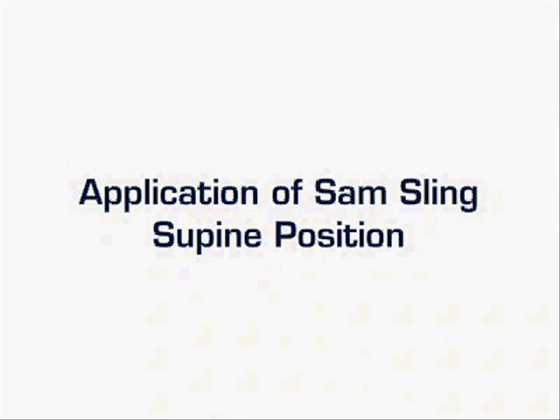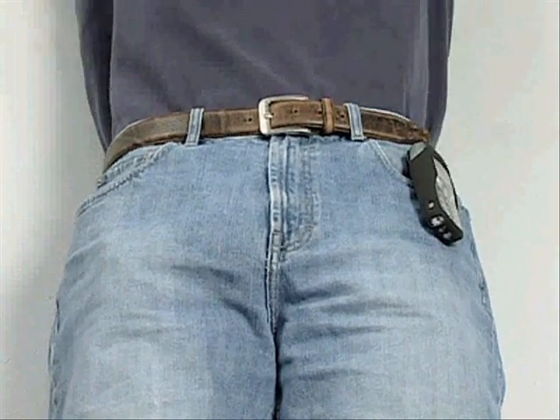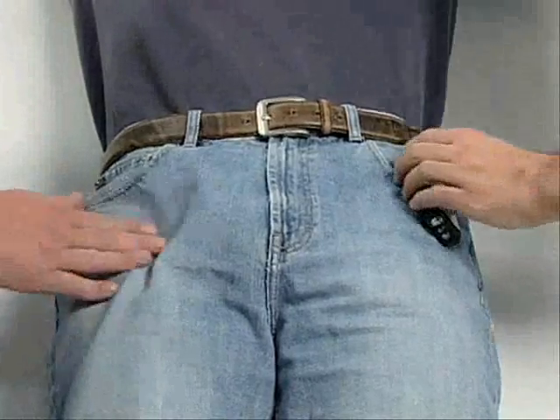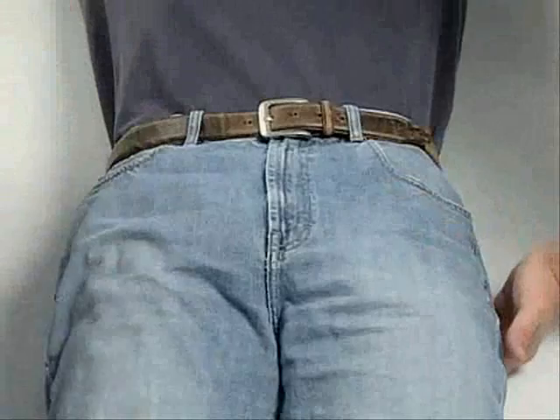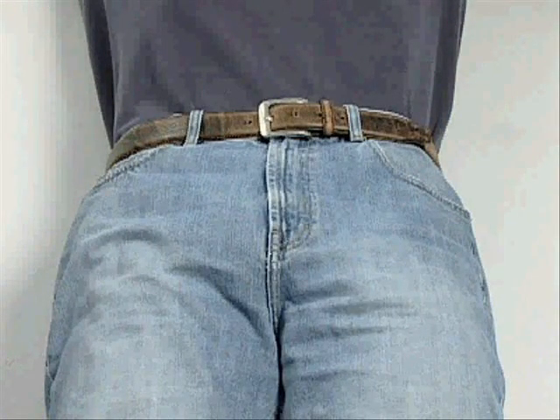SAM Sling application on a patient in the supine position. The patient may or may not be on a backboard. Before applying the sling, check the patient's belt and pockets for any hard objects, such as a cell phone or keys. You may even want to remove a large belt buckle. Also, be sure to remove any debris, such as rocks or glass, from the patient.